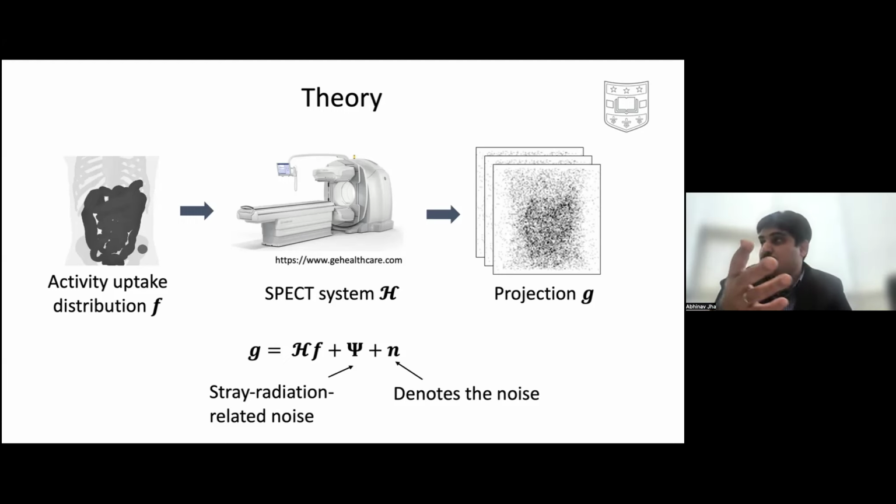From the data that I will show you, you will see that this approach does lead to very reliable activity estimates. So if the goal is quantification, and you can define the VOIs, you can do a very good job at activity quantification with this approach. So you should do recon for visualization and delineation if the lesions are not visible, but for quantification, you skip it. Or more specifically, for VOI definition for those lesions which we cannot see.